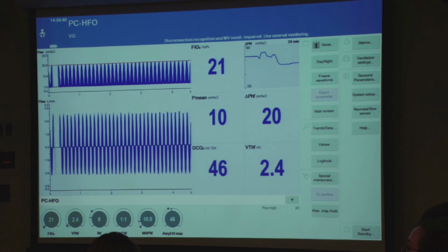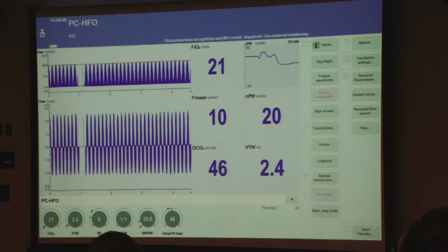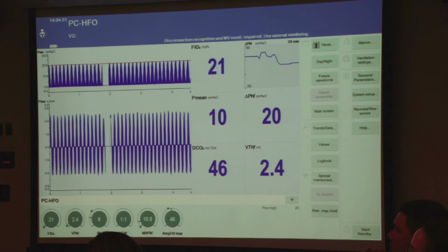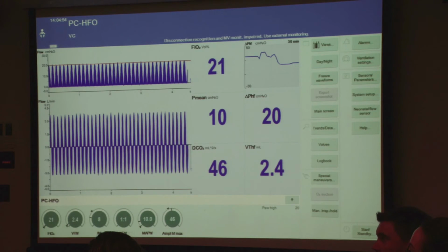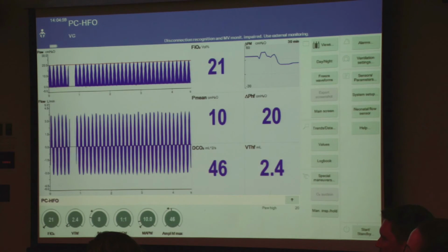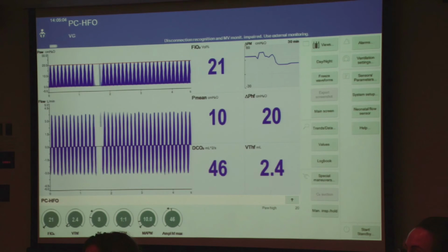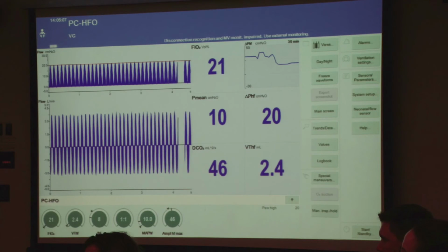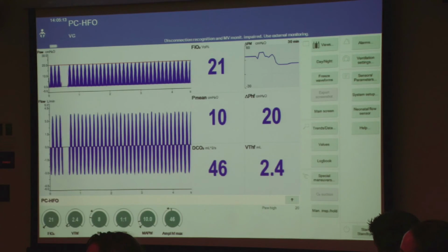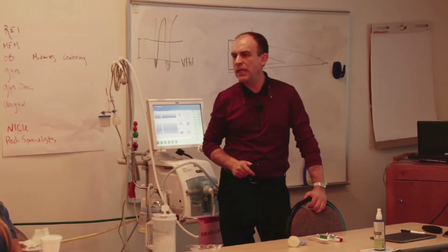But the new version of the software allows you to dial in the settings when you're admitting a patient the weight of the patient, and in conventional ventilator, it will report the tidal volume per kilo according to the weight that you made the input with, and it will also report the VTHF per kilo. And most people say, okay, below 1.5, probably you're not needing high frequency anymore.